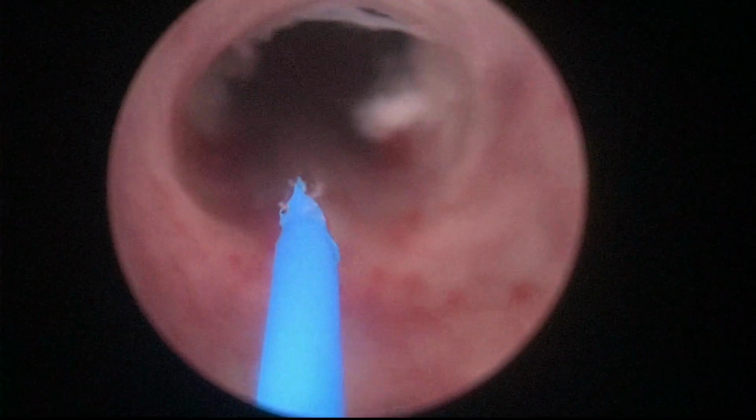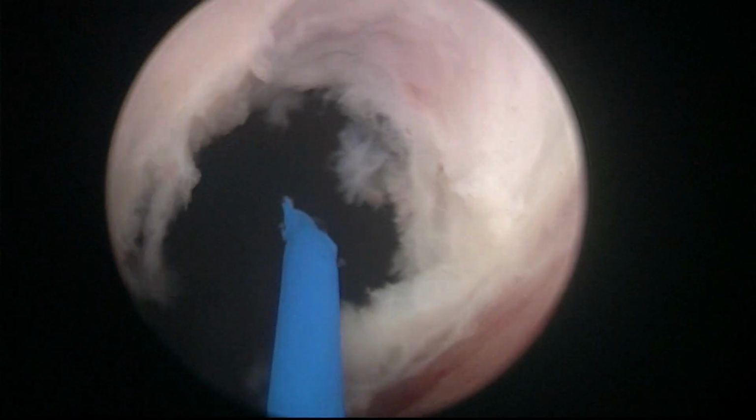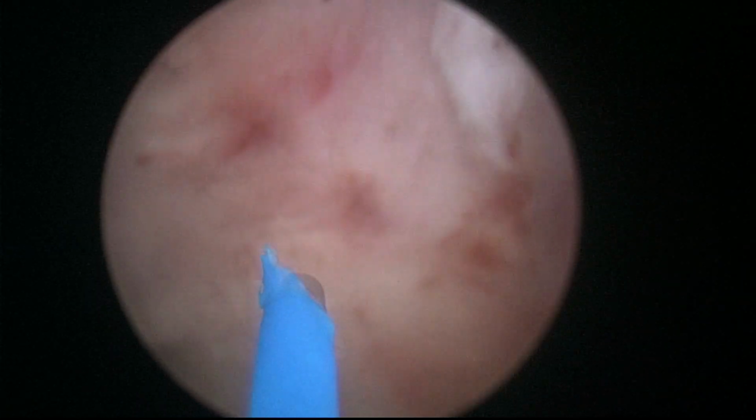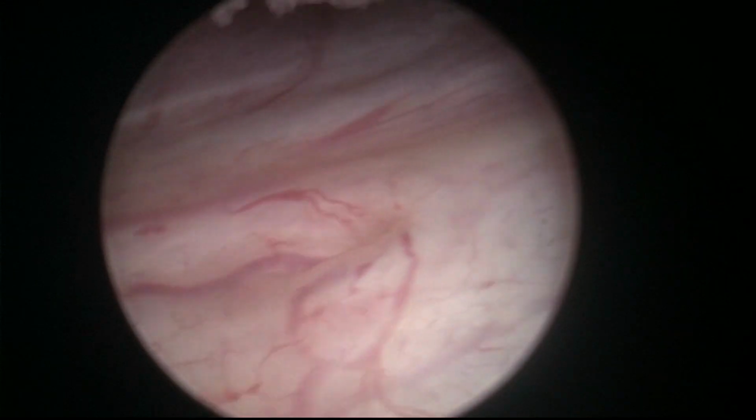Here we are at the sphincter. You see, we managed to preserve the mucosa of the sphincter. There's some reasonable shattering of the mucosa because of the pressure and the movements we had to do. Look at the beautiful hemostatic properties of this laser. Let's look at the UO. Where are you? Here and here. Okay, let's morcellate. No need to do a secondary hemostasis.